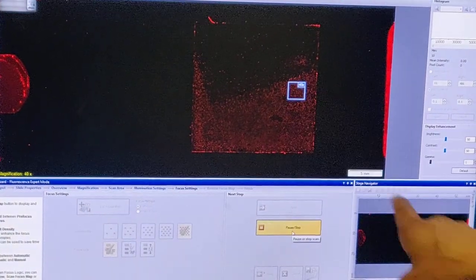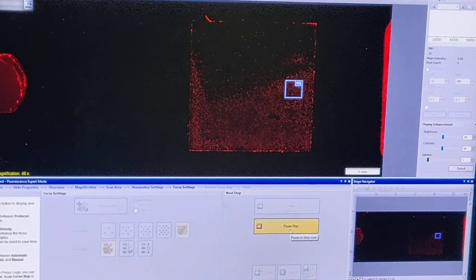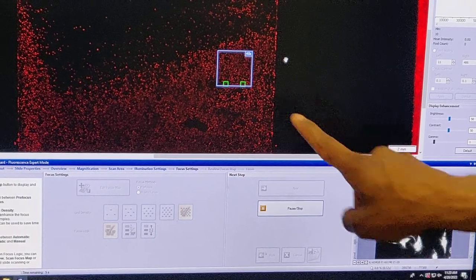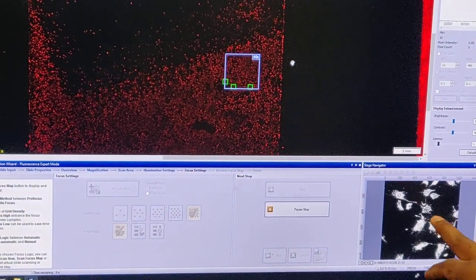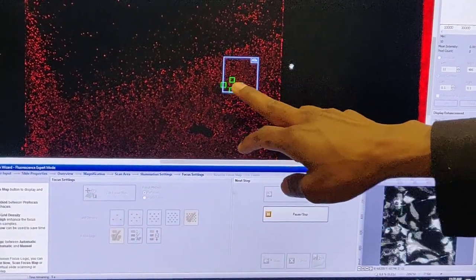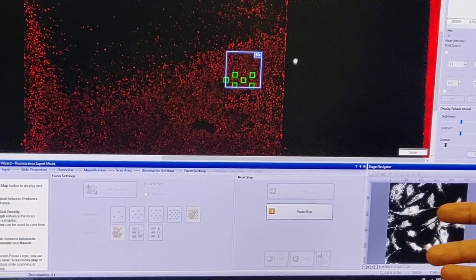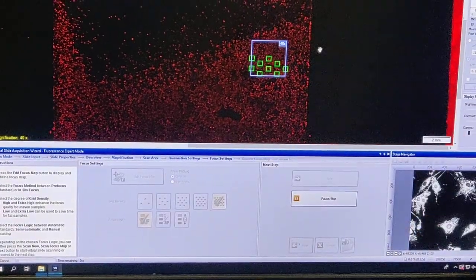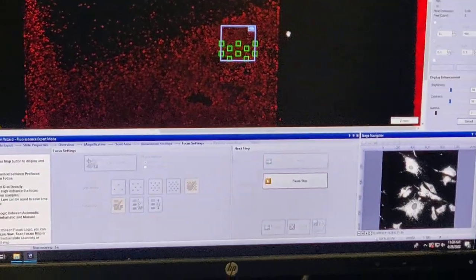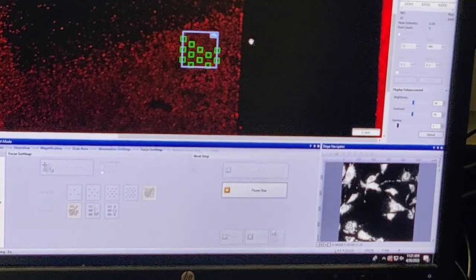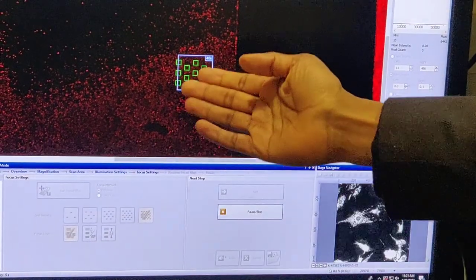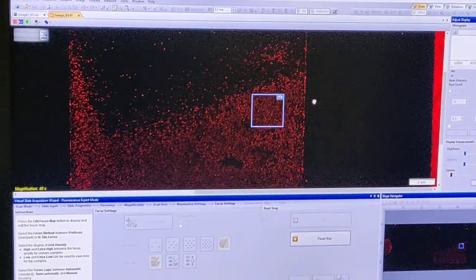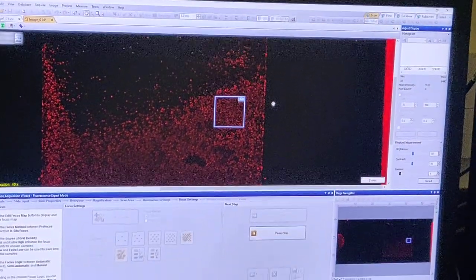Ideally the stage should go to each location and it should show green, green, green — but it's showing gray here. That's because even though it looks red or green in the viewer, the actual image is grayscale: the camera is a grayscale camera and doesn't see colors. The colors you see are false colors based on the parameters I choose. All the focal points are in focus — amazing! It rarely happens, but if sample preparation is good, it does.